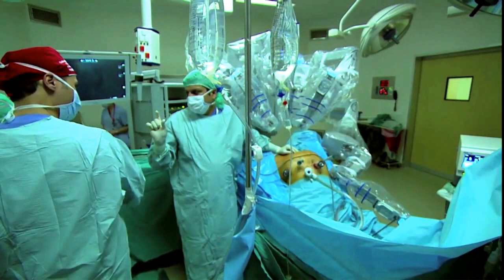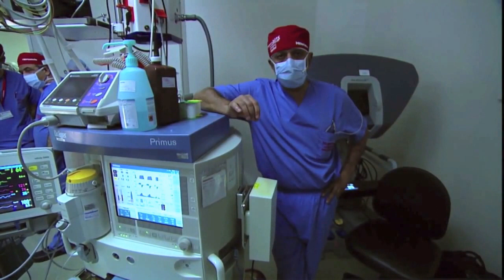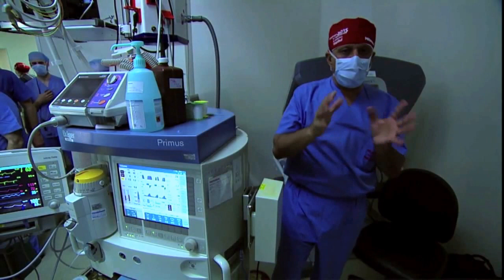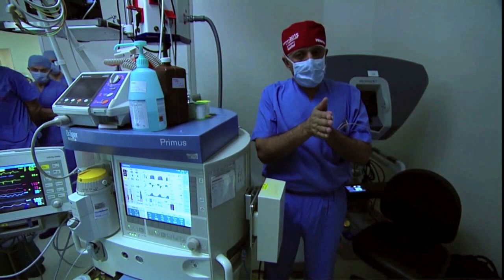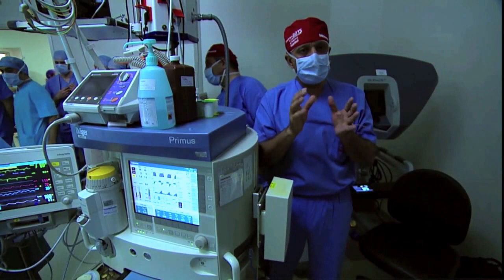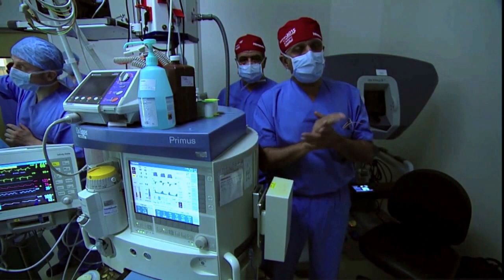I'm going to head over now to the donor room and get the kidney ready. Okay. So the kidney is in a four-layered bag made of lap sponge. It is not a regular sponge. The kidney goes in the middle, and there are two layers of the bag on each side of the kidney into which we put ice. Finely crushed ice is in two compartments, one on each side of the kidney, all within the bag. So the kidney is circumferentially surrounded by ice.